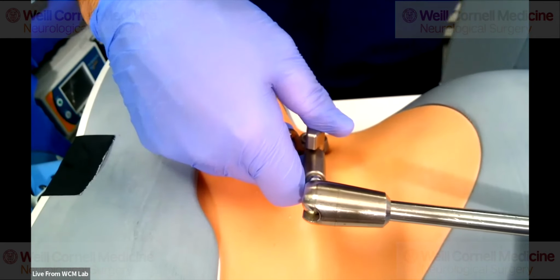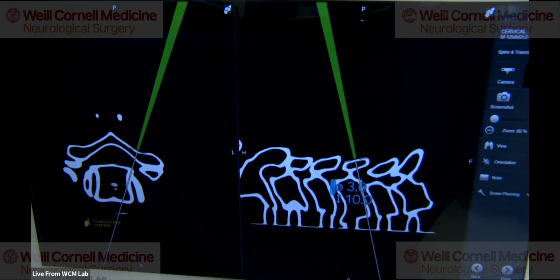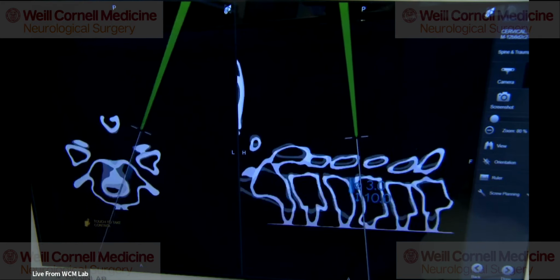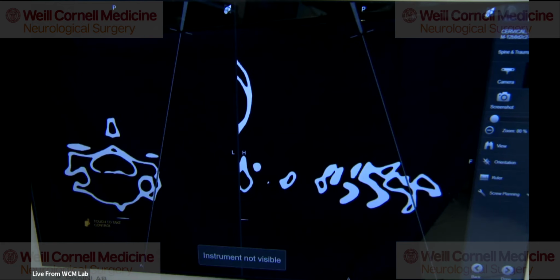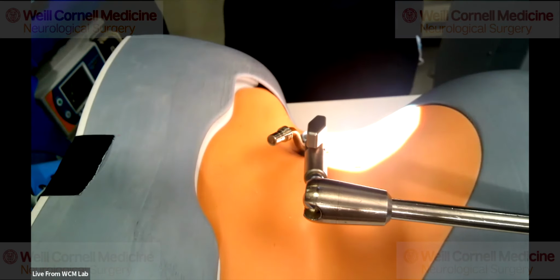So that's good here. Thank you. So this is now better, and I'm right on bone. So this is good. So now I'll bring in the microscope. While we're switching to the microscope, can we raise the table up a little bit?